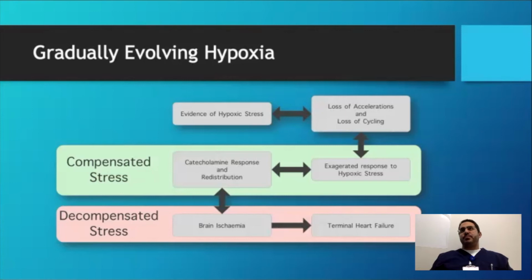Sometimes STAN comes up with a biphasic, but you've got a physiologically normal CTG, in which case you're not going to intervene just based on STAN. But if you've got an abnormal looking CTG and you're more worried about it, and STAN isn't concerning, you know that the myocardium's okay, so you can probably keep going with the labour. It's only the abnormal CTG where you would use it.